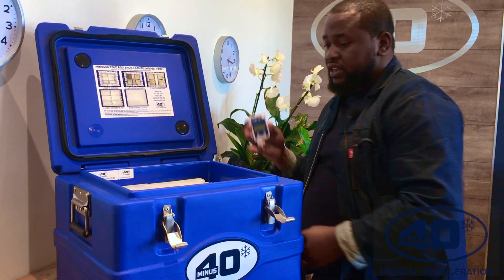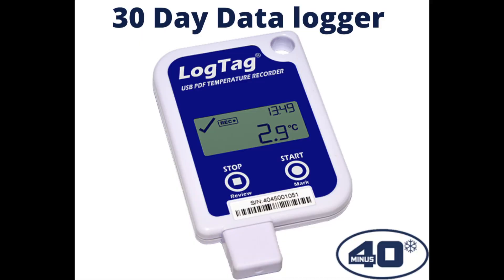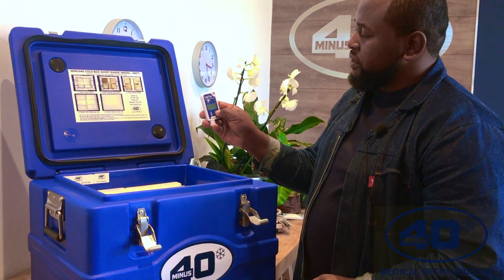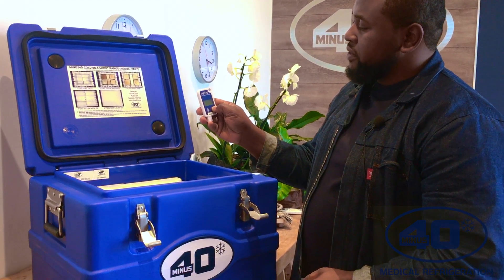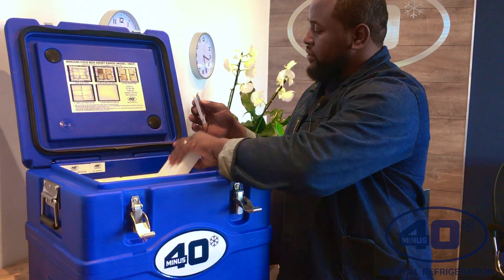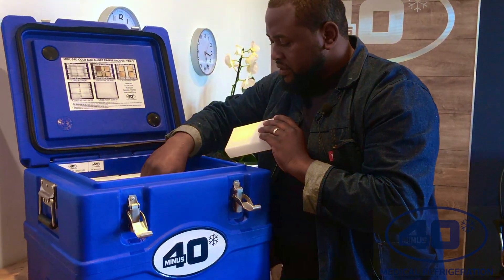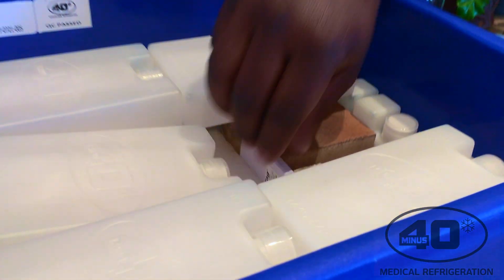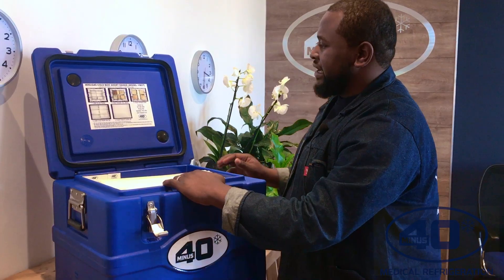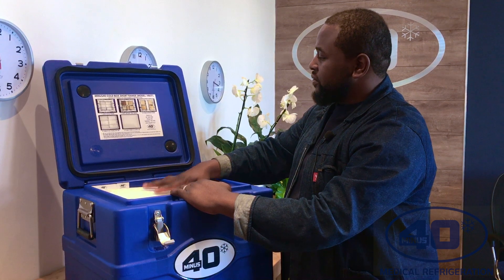If you have a LogTag, you can start it by clicking the start key. There should be a delay of half an hour. Then you can leave your LogTag inside the vaccine box. Now we're doing the last part, which is to place the foam and close the lid.